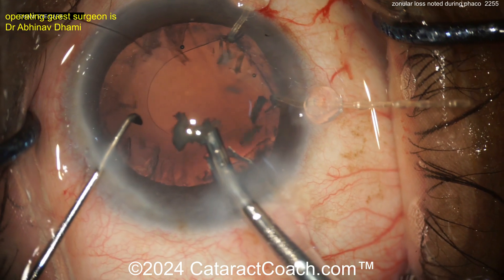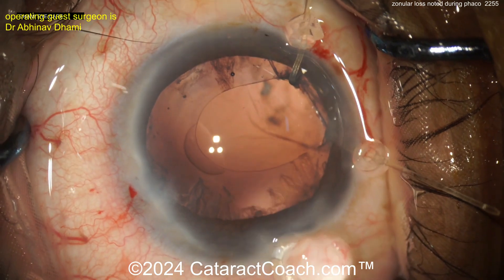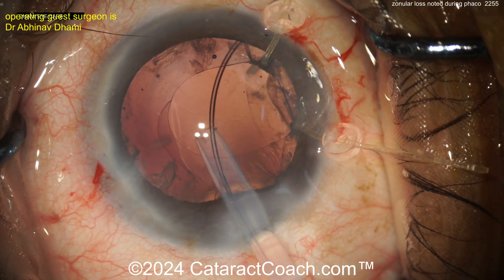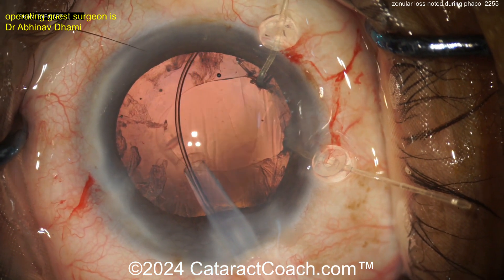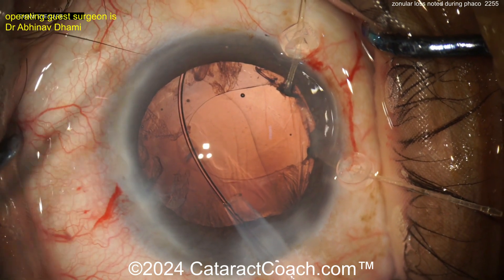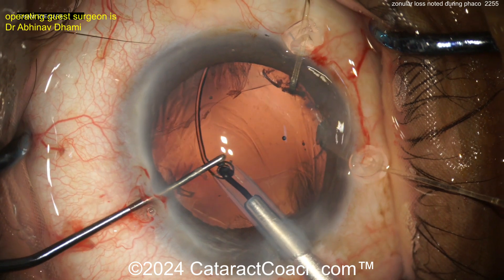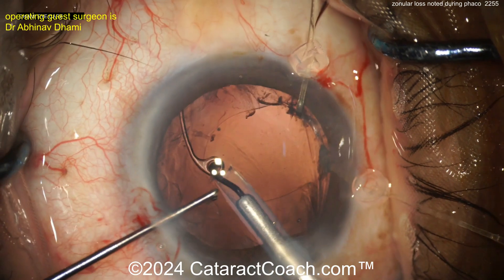Taking out that last little piece, looks pretty good. Now clean up the cortex — a bimanual setup can help a lot here. You don't want to let the bag collapse too much either. CTR going in — much easier to put this in with viscoelastic in the bag. Getting that CTR going around; I like to use a Sinskey hook to hold that leading eyelet as it goes around to make sure it seats correctly. There's the last loop of it, the last eyelet — drop that in the bag, make sure it goes in the bag. The CTR is certainly going to help.